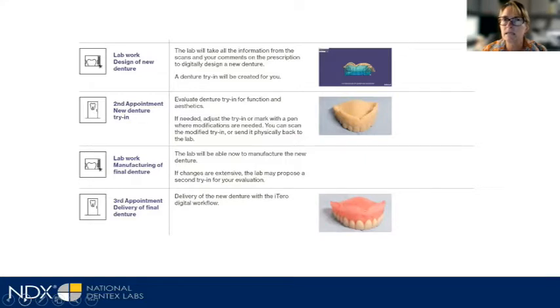So when it comes to sending this information to the laboratory, you really have lots of choices. In some cases, the laboratory might be able to go directly to a try-in with teeth set in place. Maybe it'll be a try-in with the anterior teeth set in place and posterior bite blocks, if you really needed to increase vertical or change the existing bite registration pretty dramatically.